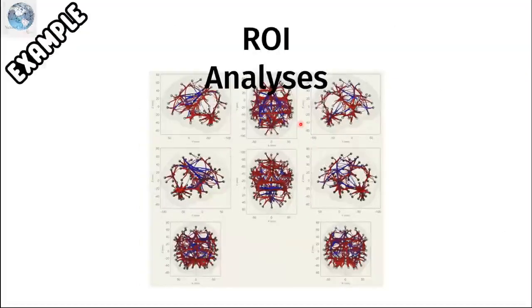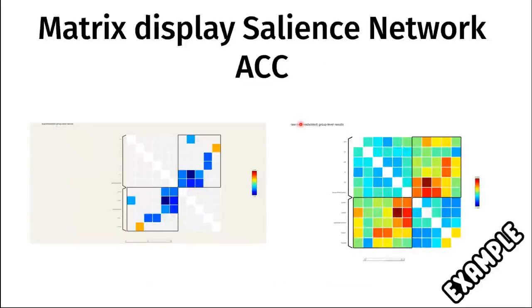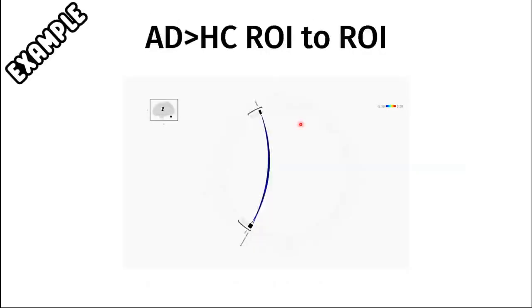And this is the other processing in the Conn-Toolbox. Other than the previous, we can also do graph theory analysis, ROI analysis, matrix analysis, and this one, the connectogram. They will highlight only what you selected. So you need to know your objective and what you want to demonstrate according to the journal that you read. Okay, so that's all from me.